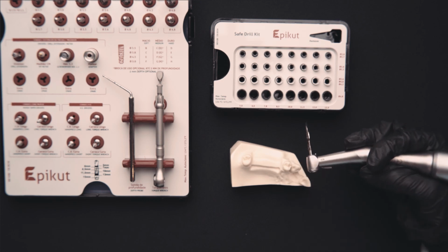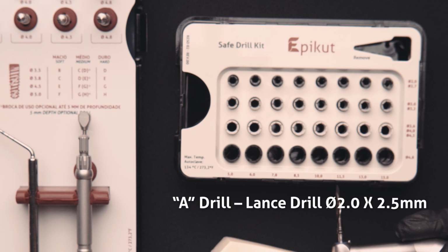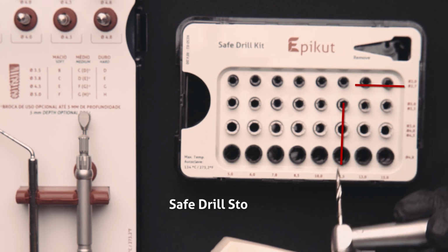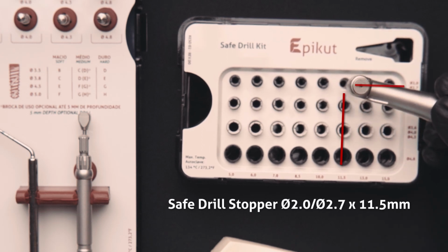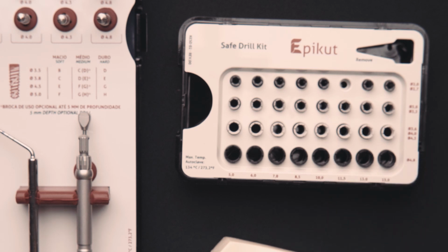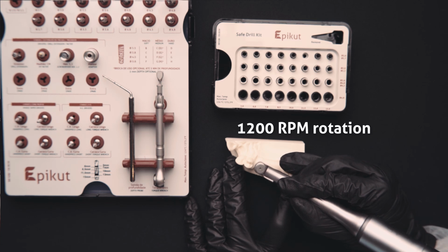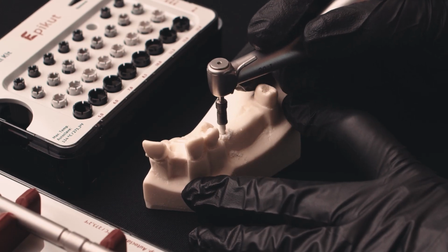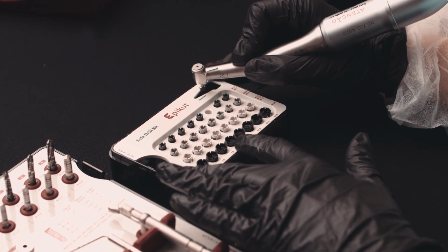For this reason, we will choose the stopper with a length of 11.5 mm. The first drill has a diameter of 2 mm to 2.5 mm. So in this sequence, the drill stopper will be chosen. To remove the drill stopper, use the removal space on the kit.